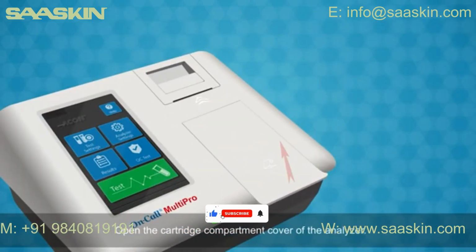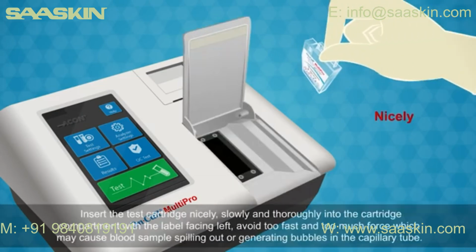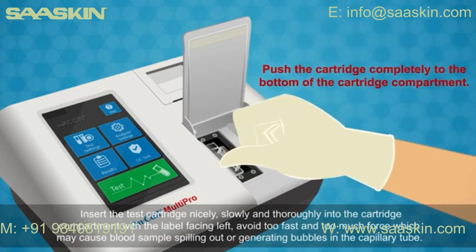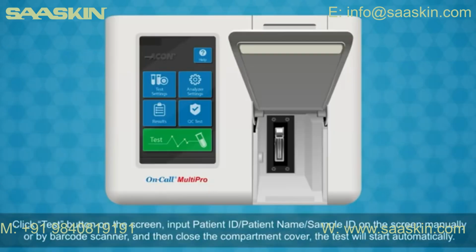Open the cartridge compartment cover of the analyzer. Insert the test cartridge nicely, slowly and thoroughly into the cartridge compartment with the label facing left. Avoid too fast and too much force, which may cause blood sample spilling out or generating bubbles in the capillary tube. Click Test button on the screen.